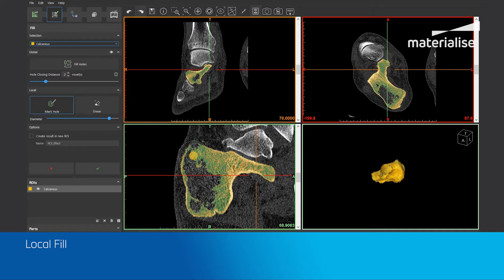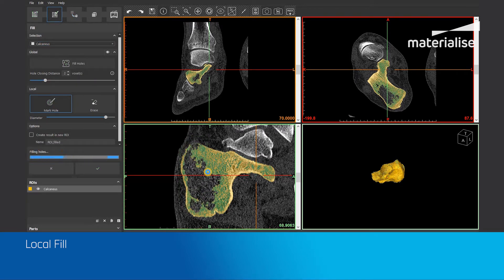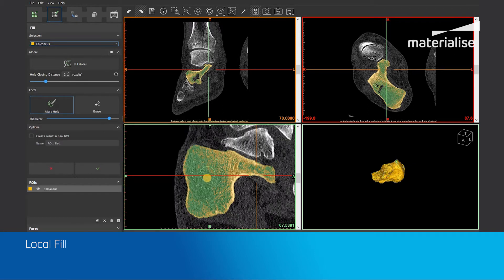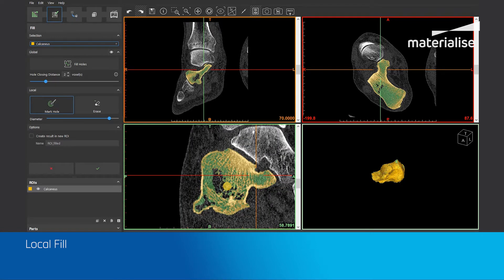When brushing, focus on the inner circle, placing it more accurately where you're sure that pixels need to be added. The outer circle can be less accurate and go outside the region because the tool will still assess whether there is a hole to fill or not. Use a larger diameter to fill up larger areas. The result is also shown in green so that you can review what is filled. Next to the mark hole option there is also the erase option that you can use to erase small parts. This will only erase the filled up areas and will not change your input region of interest.